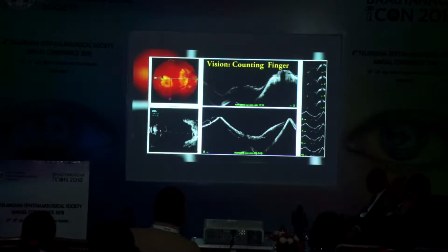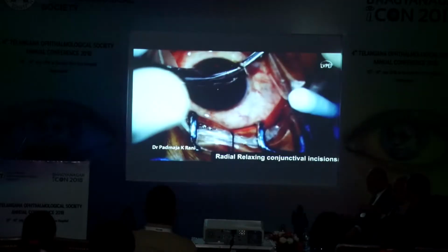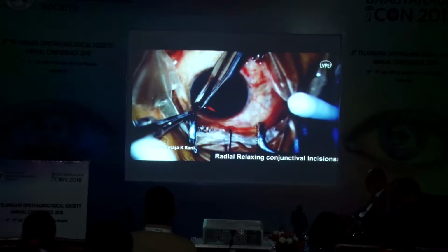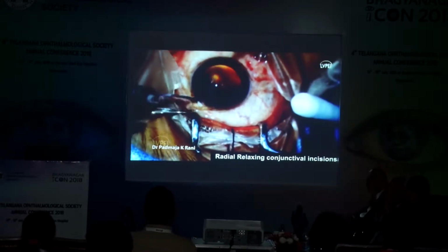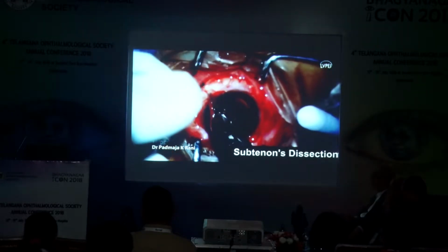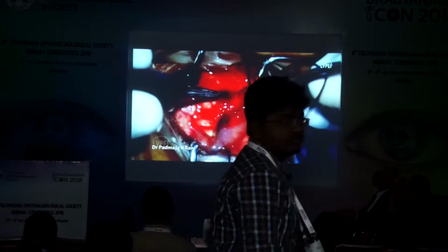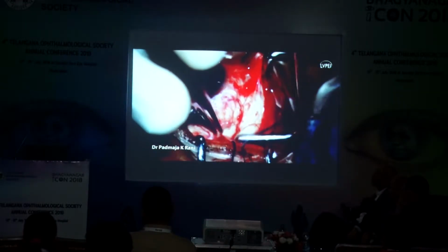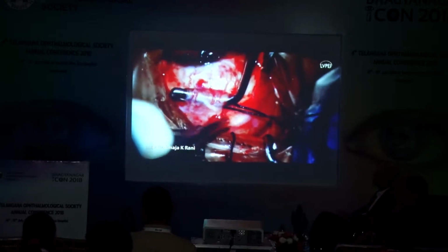The macular buckle surgical procedure was planned for episcleral macular indentation. A 360-degree conjunctival peritomy was done with radial oblique relaxing incisions, while avoiding horizontal incisions to prevent buckle exposure. The subtenon dissection was adequately done in all 4 quadrants. The 4 recti muscles were tagged with a 2-0 silk suture. The muscle was adequately exposed, beginning with tenon dissection at the lateral walls of the muscle.